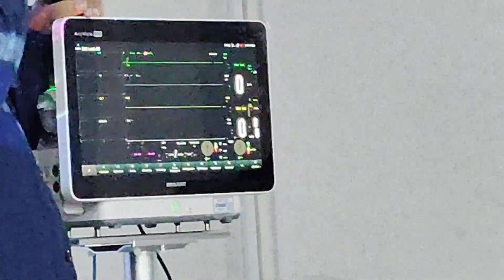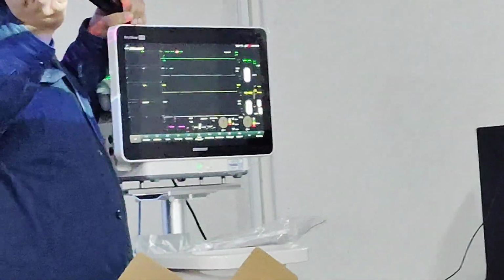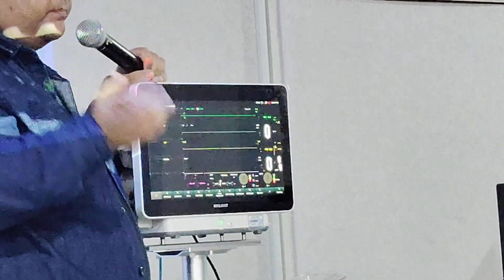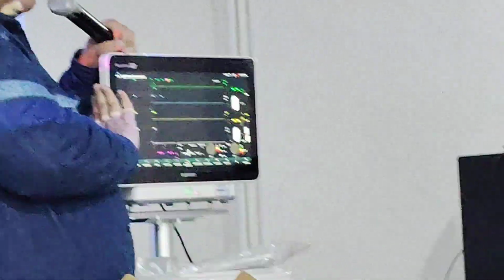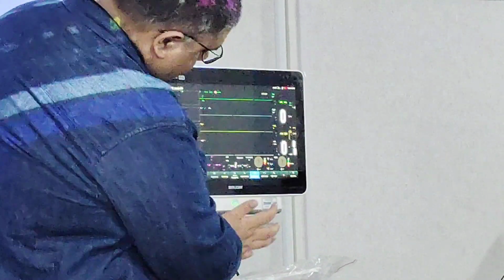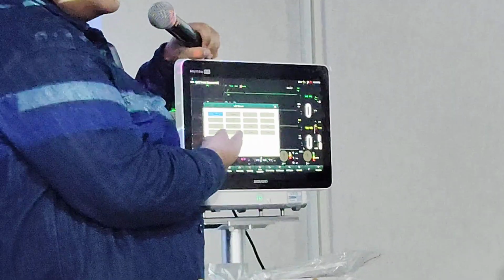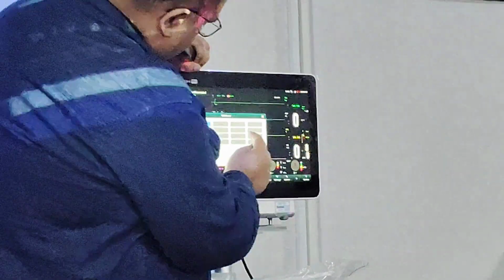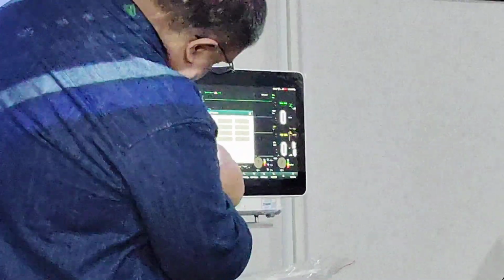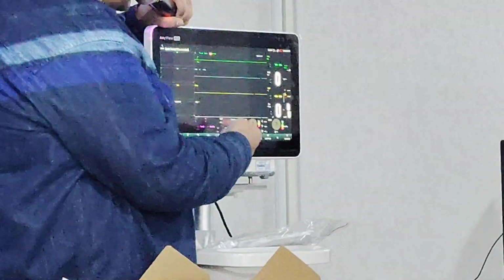So for example, I want to monitor a patient's blood pressure over a period of 8 hours, let's say in the morning. So we can set the NIBP sequence, if you guys know that. I can go over NIBP measure, and I want the NIBP to be measured every hour. So I can just click the 1 hour one. Where is it? 30 minutes? No, 1 hour. So I click this one.